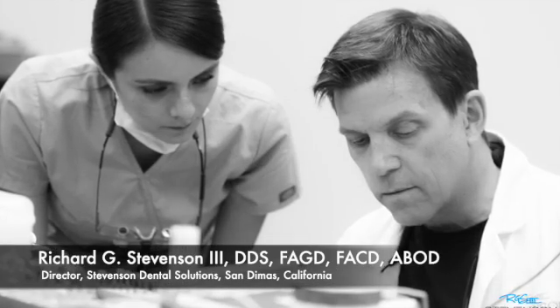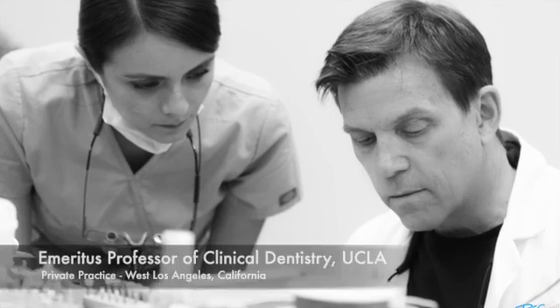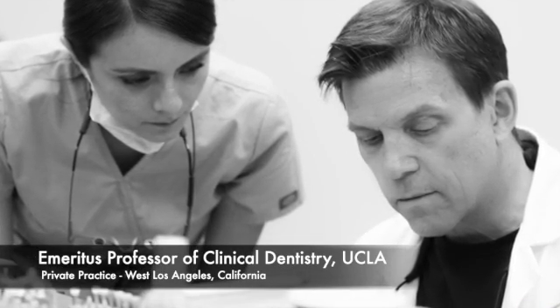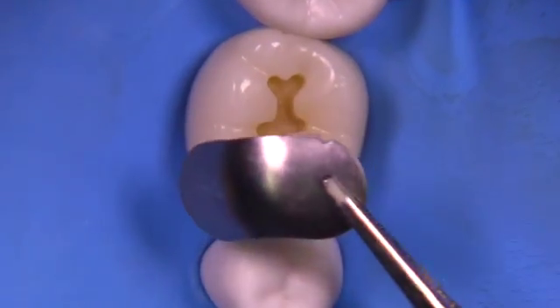Hi everybody, I'm Dr. Richard Stevenson. I'm the director of Stevenson Dental Solutions in San Dimas, California. I'm also an emeritus professor of clinical dentistry at UCLA with a private practice in West Los Angeles. Today we're going to cover the composite restoration for tooth number 30 for the ADEX or CDCA examination.